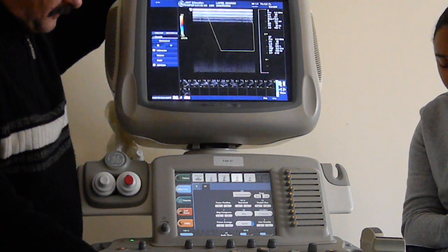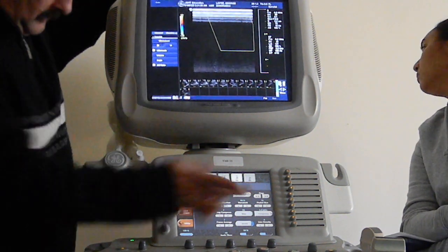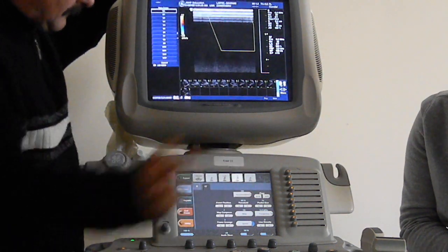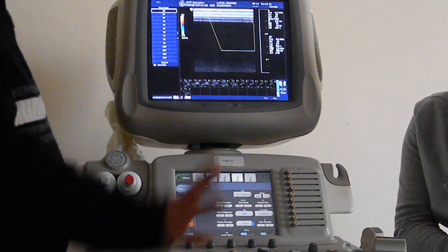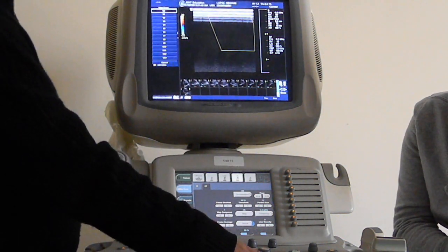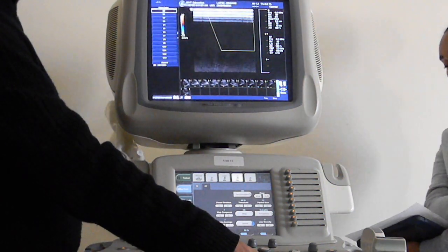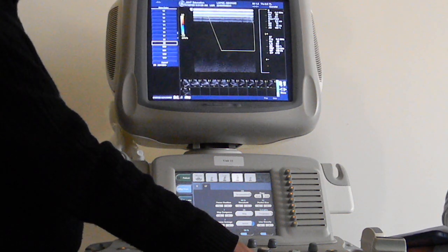Right now it's map V0. If you don't want map V0, you want to go for another map. Here is your list, and it's probably going to be easier to appreciate the difference of the map as I slide down.